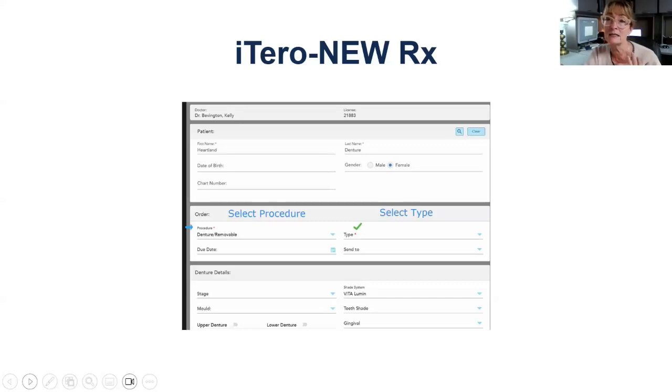And again, it's Dentsply Lucitone Print. Dentsply has been in the denture business longer than I've been involved in dentistry. I think it's 75 years, 100 years now. But I'm happy that we went with a manufacturer vendor that's sort of tried and true within that industry. So we're not experiencing repairs yet.